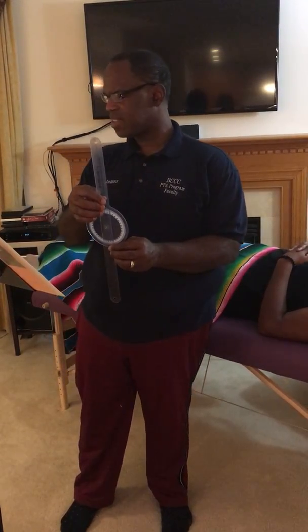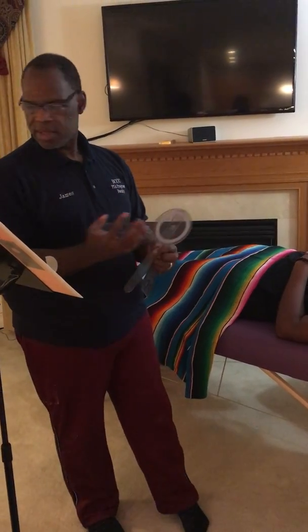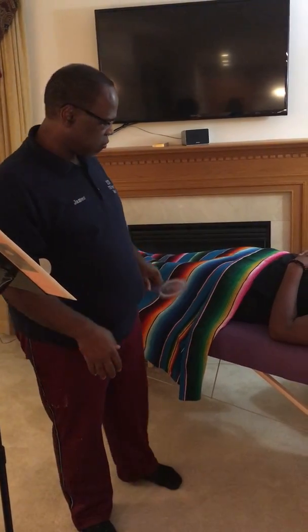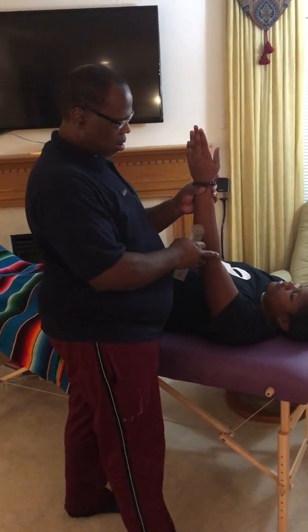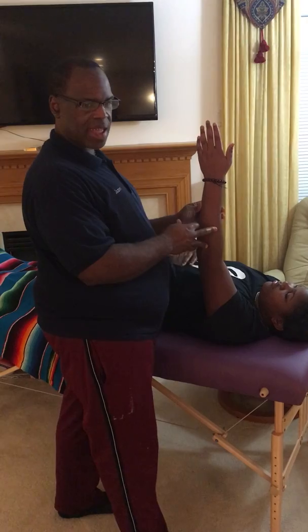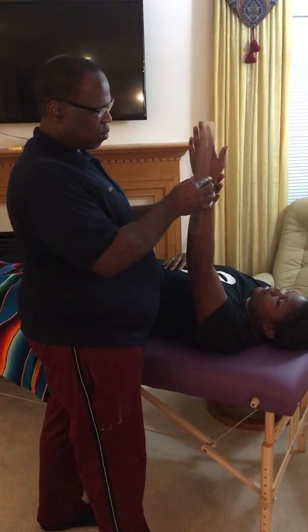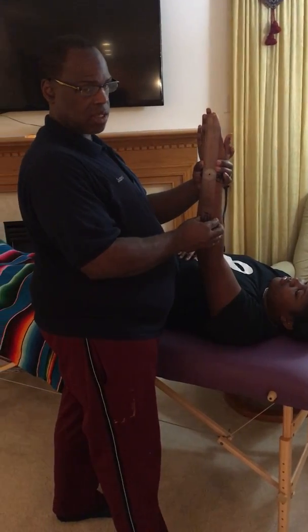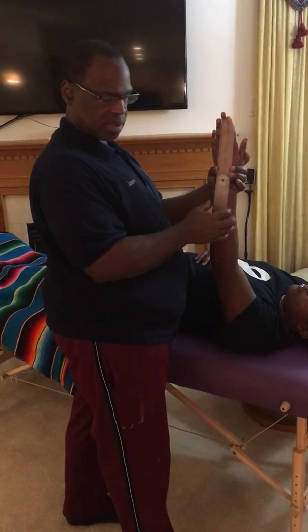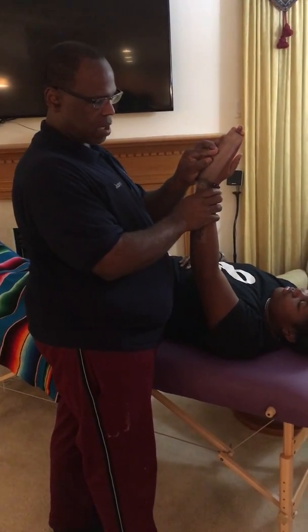All right, so let's show one example. Let's look at wrist extension. Now let's do ulnar and radial deviation. We'll do that instead. So here is the arm, and I'm just putting it this high so that you can see. Again, the goniometer is on the body part this way, and it is starting in the open position. If the wrist moves this way, the goniometer will follow.